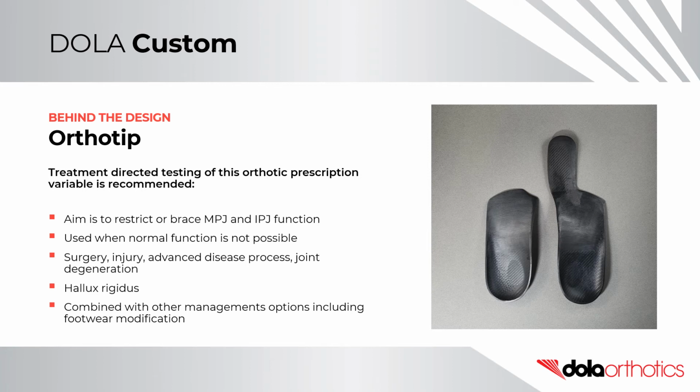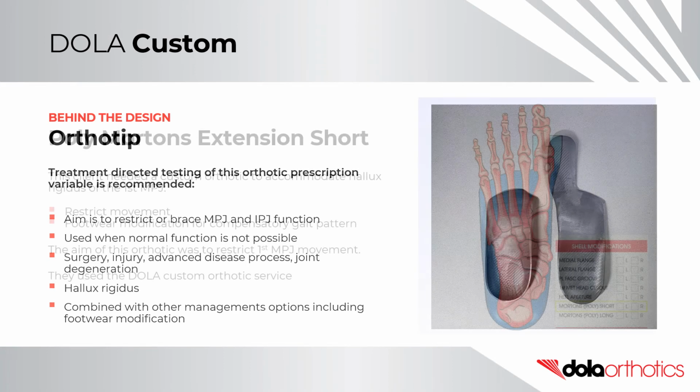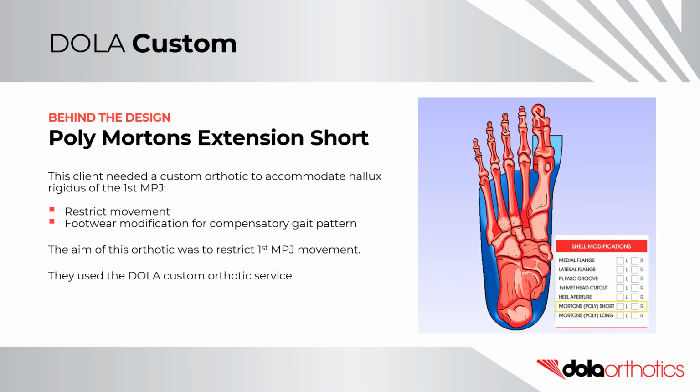This treatment option is often combined with other management options, including footwear modification. Behind the design, Poly Morton's Extension Short. This client needed a custom orthotic to accommodate hallux rigidus of the first MPJ. The aim of the orthotic was to restrict movement, while footwear modification was used for a compensatory gait pattern.